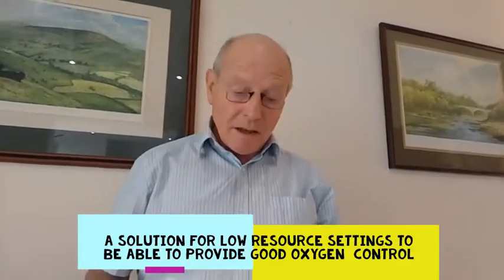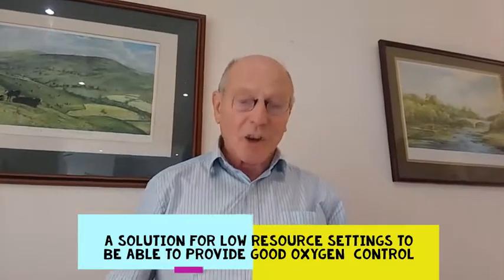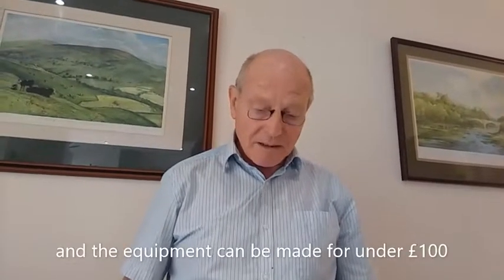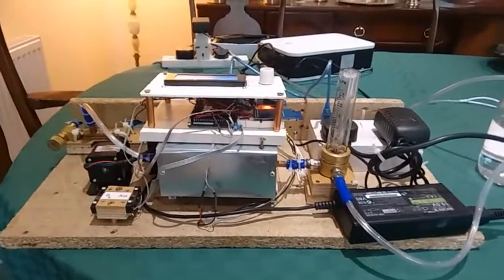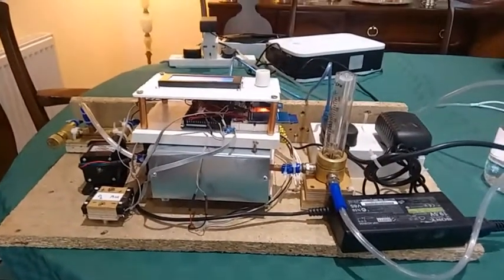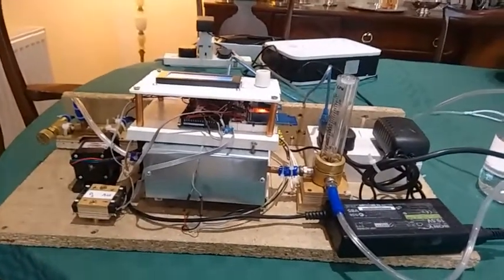The same is possible for neonates, and the cost is under £100 for each piece of equipment. Here is a prototype of the machine, built on the kitchen table, or in this case, the dining table.